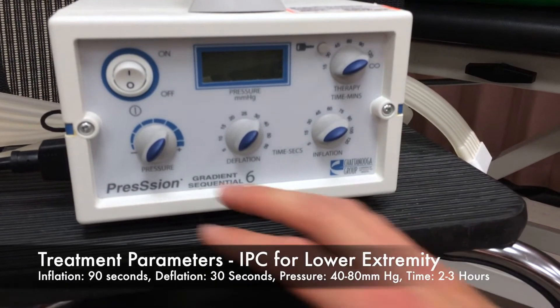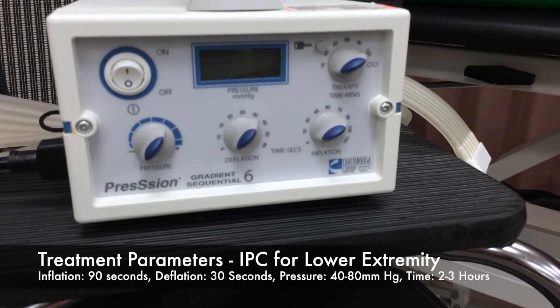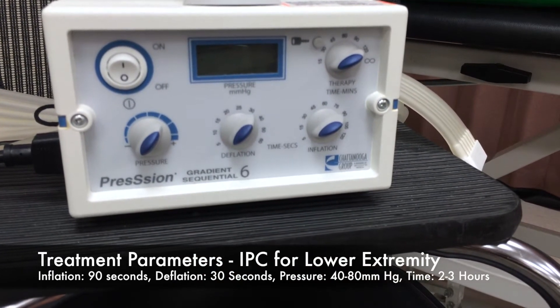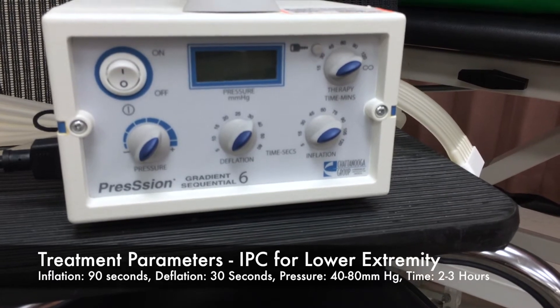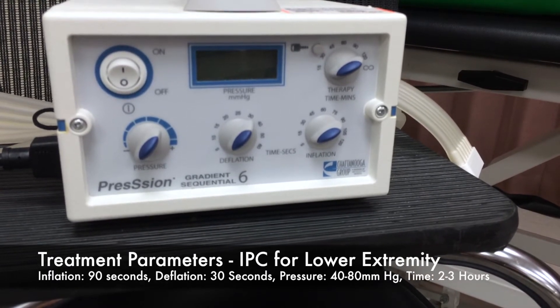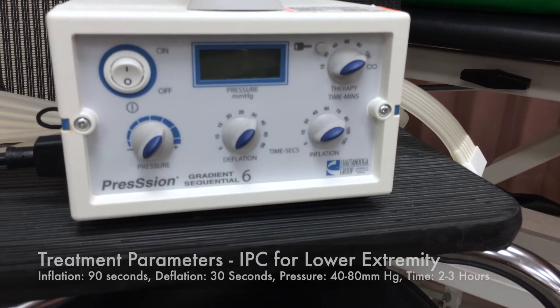We're going to adjust the pressure as soon as the treatment begins. Ideally, we want this between 40 and 80 millimeters of mercury, and we're going to start at 40. Total treatment time, we're aiming for two to three hours.